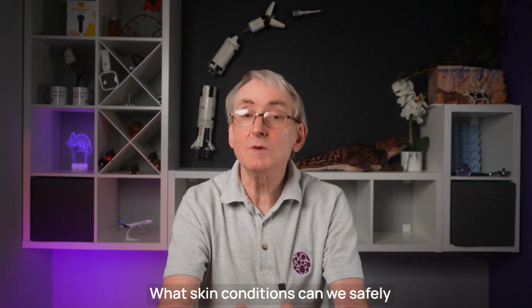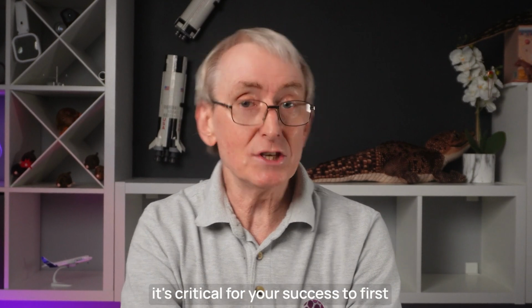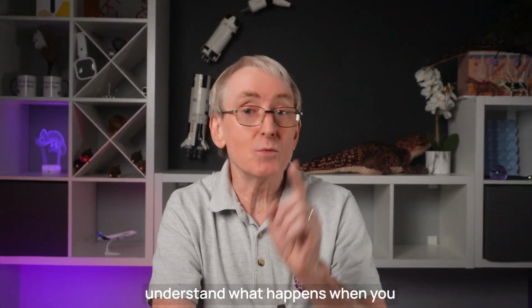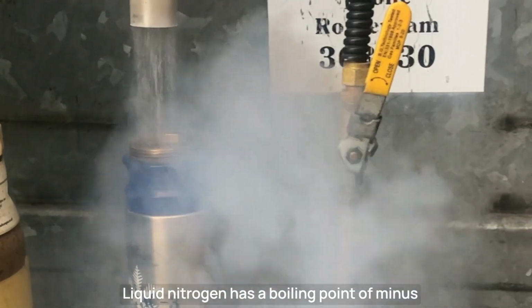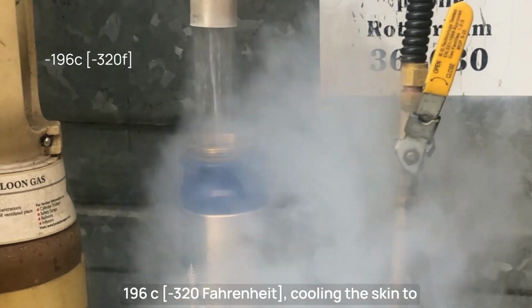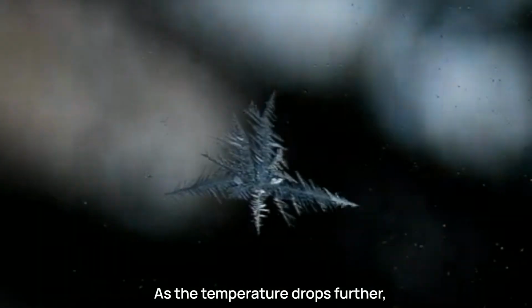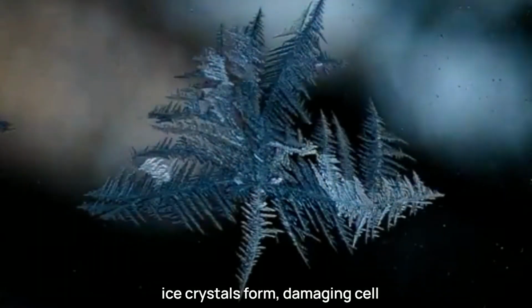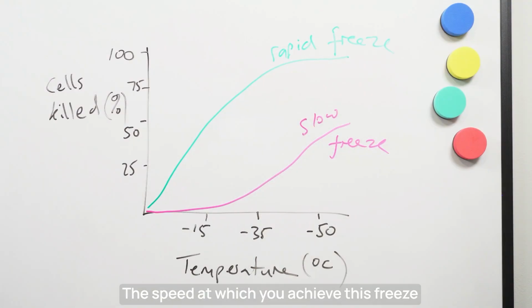What skin conditions can we safely treat in primary care using cryotherapy? Before we can answer that question, it's critical for your success to first understand what happens when you apply liquid nitrogen spray to the skin. Liquid nitrogen has a boiling point of minus 196 centigrade. Cooling the skin to about minus 10 causes little cell damage. As the temperature drops further, ice crystals form, damaging cell membranes and intracellular structures. The speed at which you achieve this freeze affects how effective it is at cell destruction.